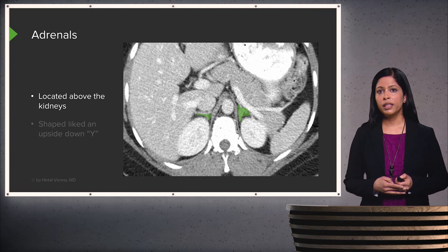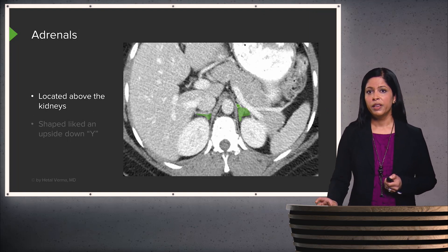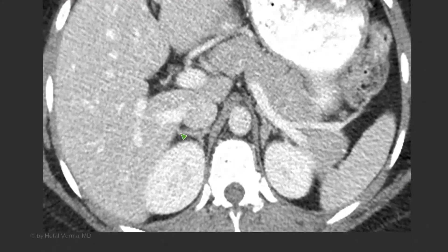The adrenal glands are located above the kidneys. They are shaped like an upside-down Y. They are small and can sometimes be hard to identify, especially when there is adjacent pathology.